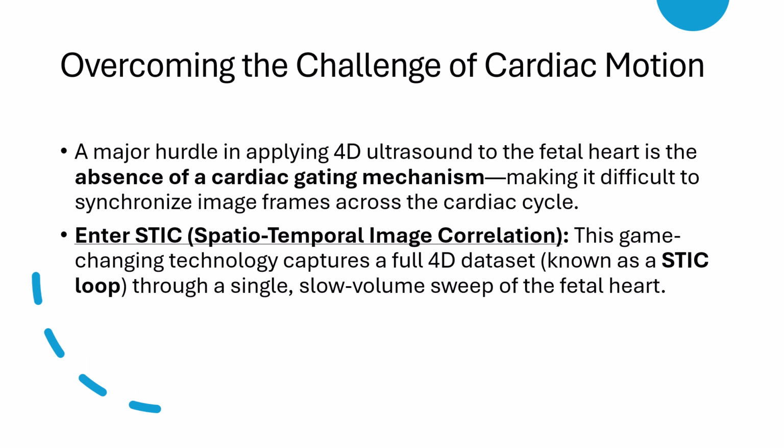STIC is a revolutionary technology that captures a full 4D dataset of the fetal heart through a single slow volume sweep. What's impressive here is that it doesn't require continuous scanning, but instead gathers a series of frames that are temporally correlated to simulate a complete cardiac cycle.